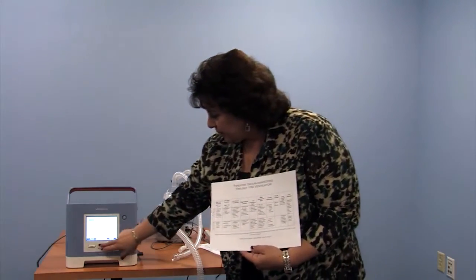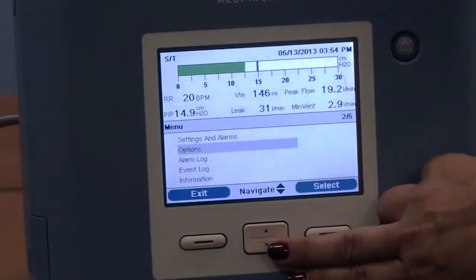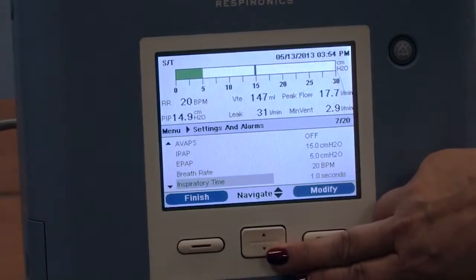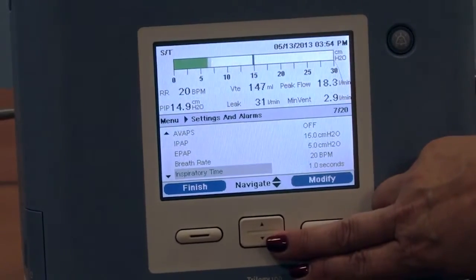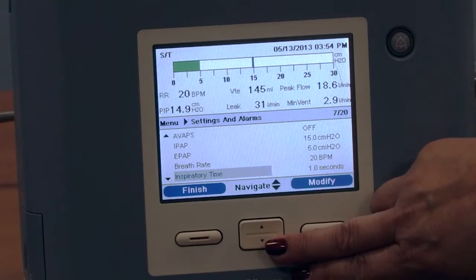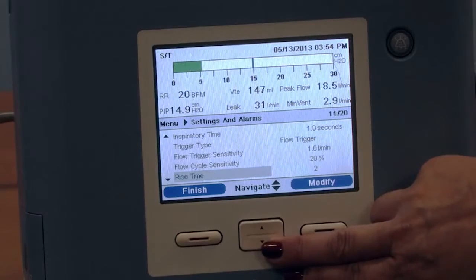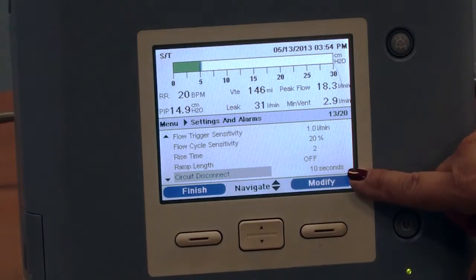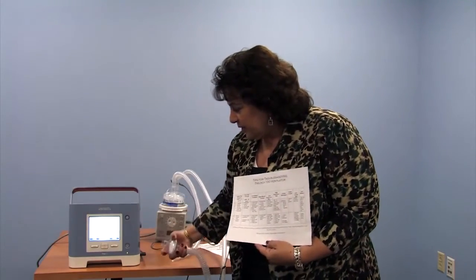Over on the machine, if we go into the menu, we can go into settings and alarms. The alarms are the same for all the different modes of ventilation. It's up to the caregivers and the family and the providers to determine which alarms are appropriate for your child. So our first alarm is circuit disconnection, and we can set time in seconds until we will know that the patient is disconnected.